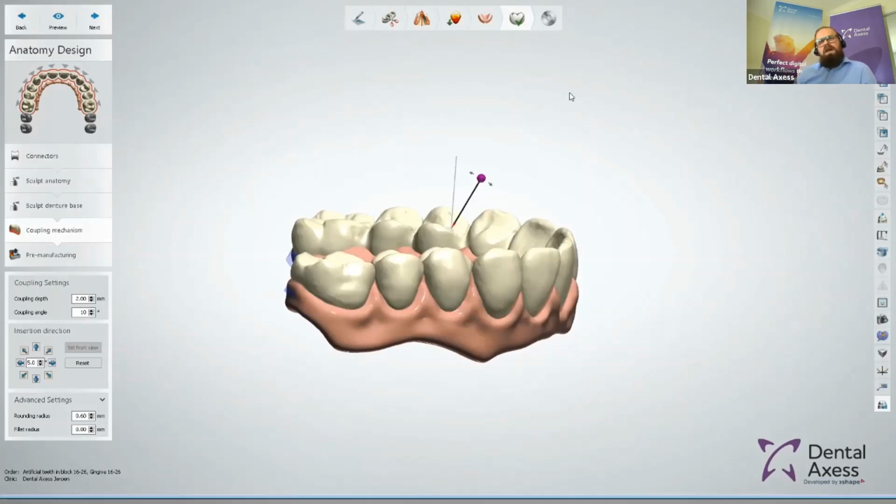If you put it in this angle, you create much more space between the lowest part of the basal area and your gingiva area, so you block that basically, see it as opaque. It blocks it out, so you don't see it as much, and it gives a much better result. This is definitely possible when you're working in bridges. When you have single teeth, it doesn't work like that. But if you work in bridges, even 1, 2, 3 bridges, it all depends on how you want to design and manufacture. You will have this option activated.